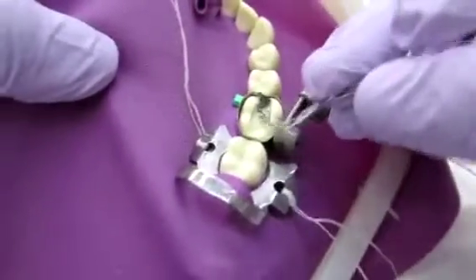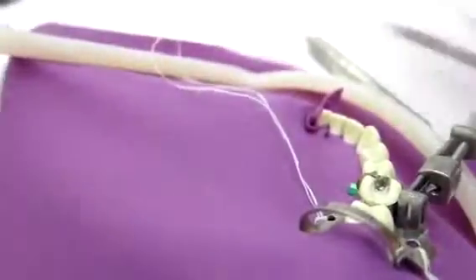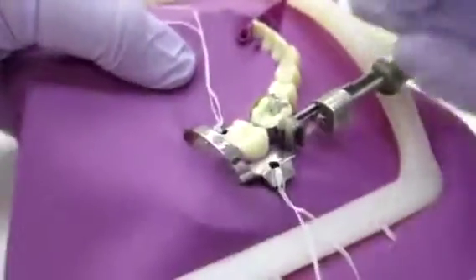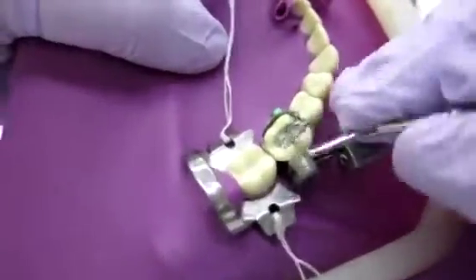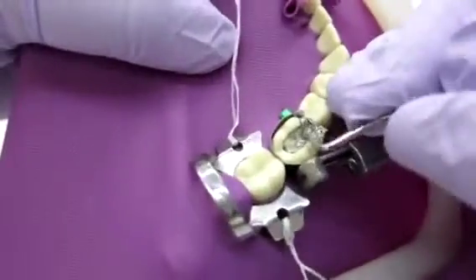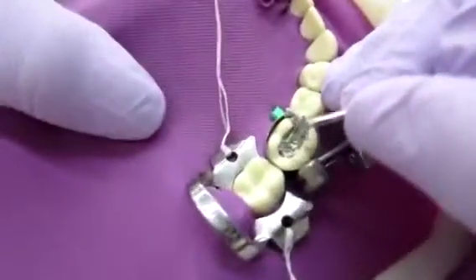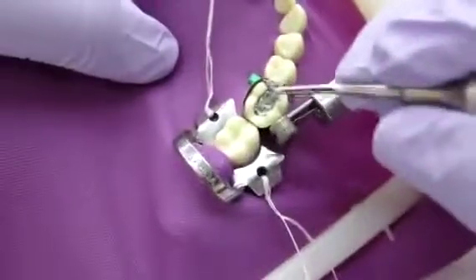Go side to side, buccal-lingually, and also push against the adjacent tooth. You only spend a couple seconds and then go ahead and pick up more — no more than 30 seconds in between condensing because amalgam does have a time limit. Add more amalgam and condense with a nice amount of pressure. The better you condense it, when you go to carve, the prettier it's going to be — there are not going to be any pores. So again: buccal, lingual, and then against the adjacent tooth.